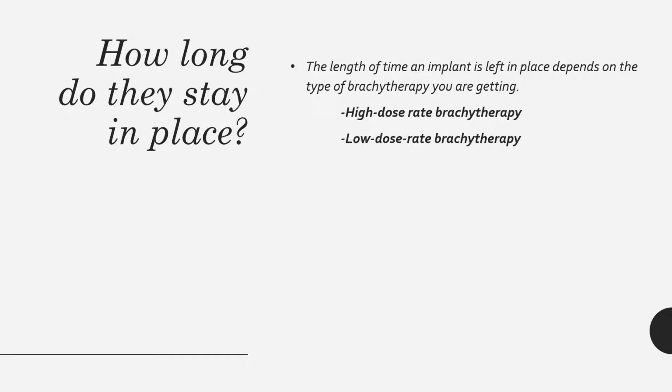If you're receiving low dose rate brachytherapy, in this approach, the implant gives off lower doses of radiation over a longer period of time. Some implants are left in from 1 to a few days and then removed. You'll probably have to stay in the hospital, sometimes in a special room during this treatment, since you are receiving radiation. And for larger implants, you might have to stay in a bed and lie still to keep it from moving.